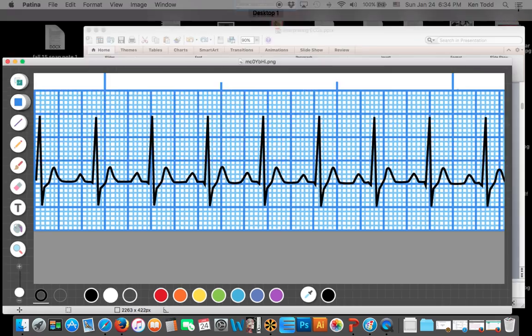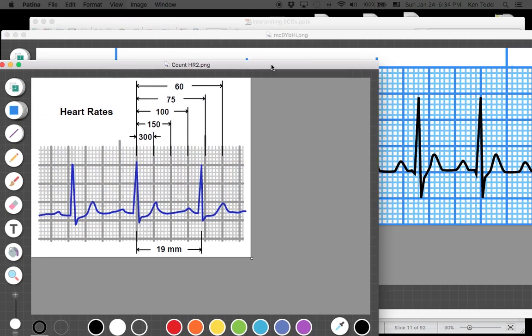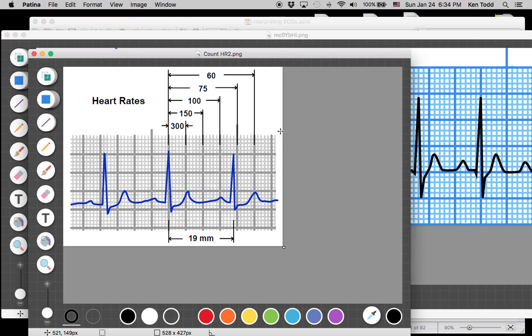There's actually a nice little mathematical formula, or not even a formula, just numbers that you should know. This is another one to always remember. But if you can remember the 3 to 5 boxes, that'll help narrow it down very quickly.